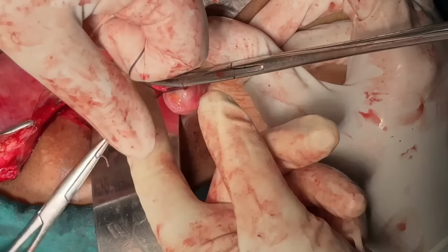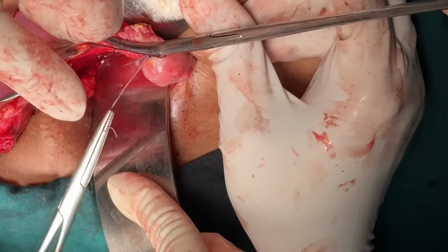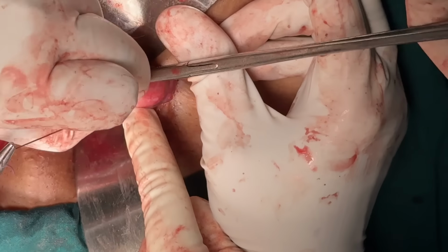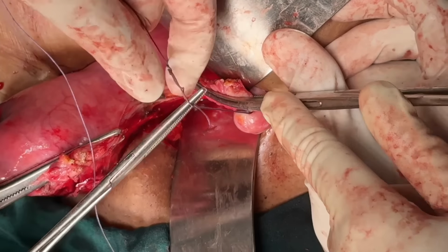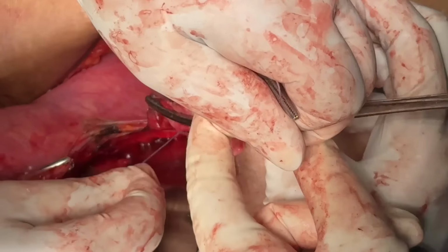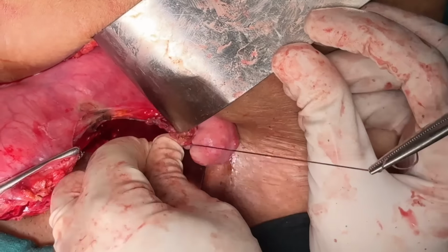And as I have told you, you must learn and practice correct knots. We already have two videos which are dedicated, on a model and a real patient, making you understand the exact technique of how we transfix the pedicles. So if you want, you can go there and watch those videos.